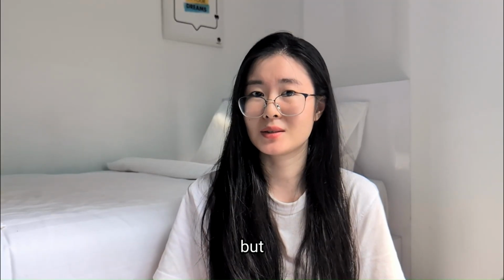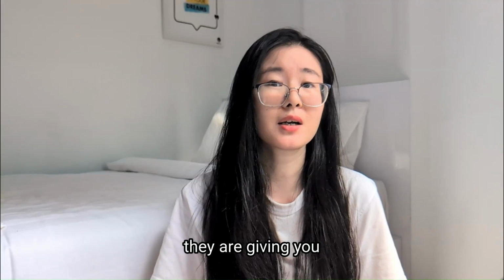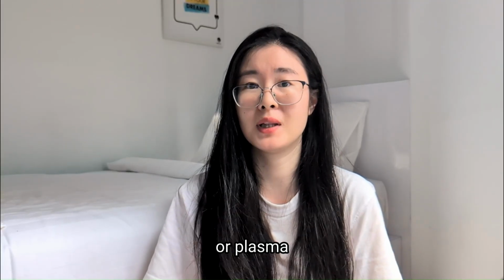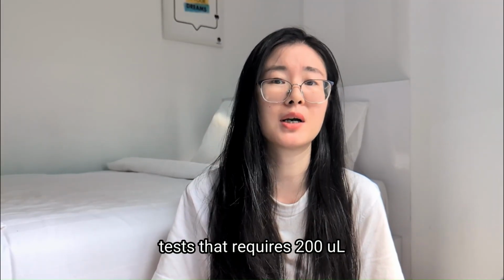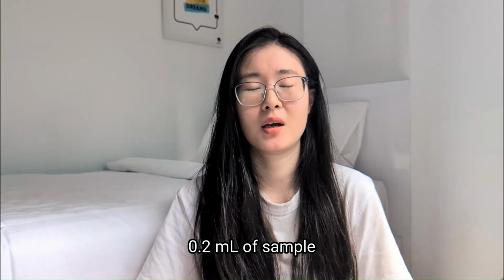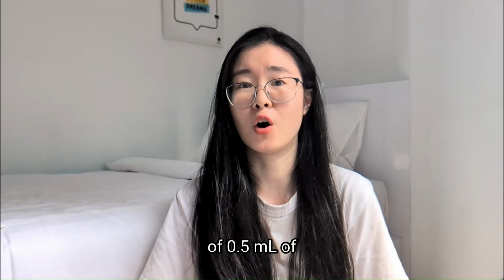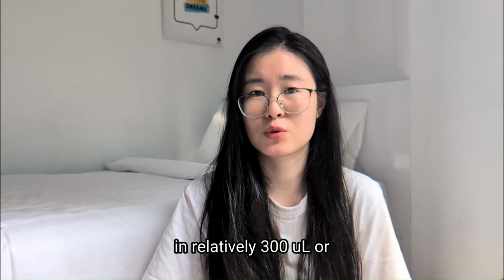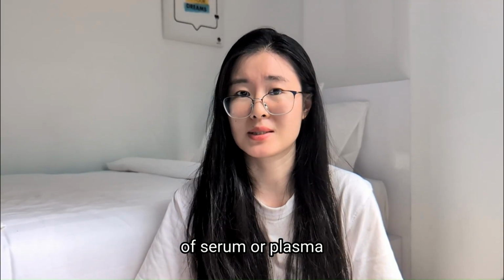A lot of times, the minimum volume on the test catalog is the volume based on the spun down serum or plasma, not the whole blood. If you see some tests that require 200 microliters or 0.2 ml of sample, it actually means approximately half a ml of whole blood. And after we spin it down, it will be left with relatively 300 microliters or 0.3 milliliters of serum or plasma for testing.